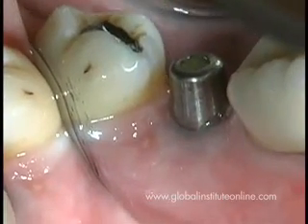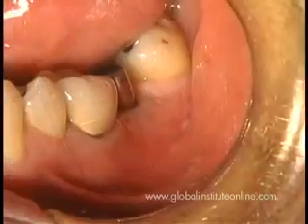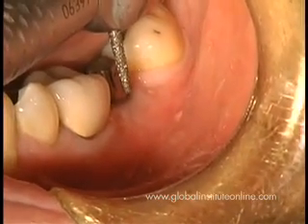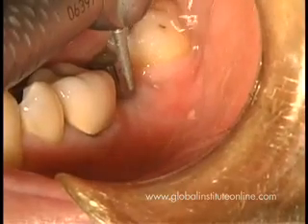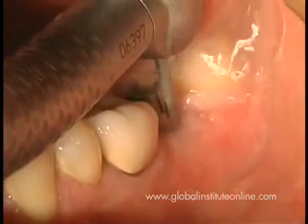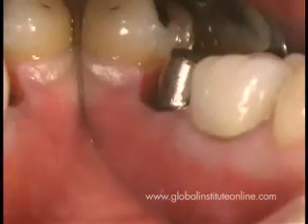After that period of healing, the patient is called back now for the preparation of the titanium head of the implant. The temporary is removed, the site is cleaned, and then a diamond burr with copious irrigation is being used to prep a margin to host the new crown, the final crown. We're going to stay with this prep margin just like slightly subgingival or even pergingival.